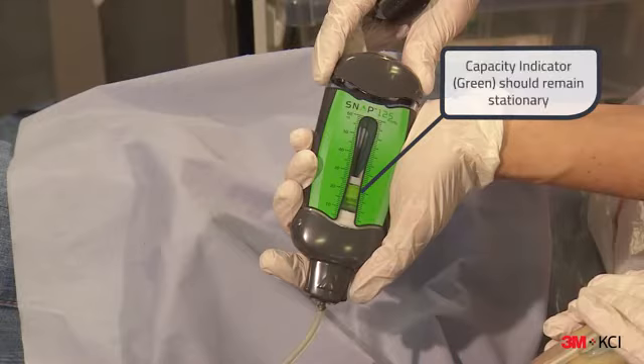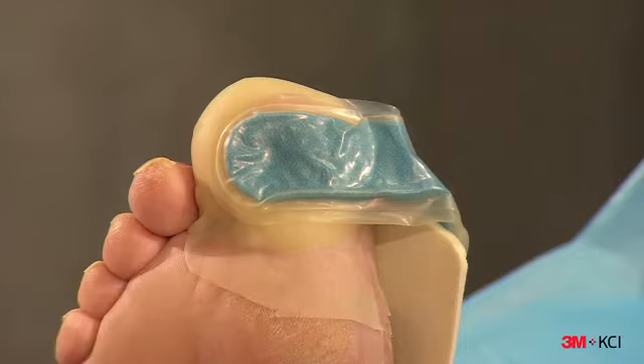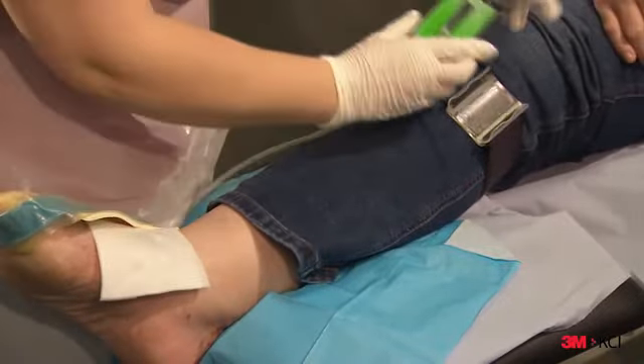The green visual indicator should remain stationary to verify that there are no air leaks and excess air is removed from the system. In addition, the dressing will have a sucked down appearance and the dressing will also feel hard to the touch. The Snap Therapy cartridge can be secured to the leg, arm or belt with the Snap Therapy strap.